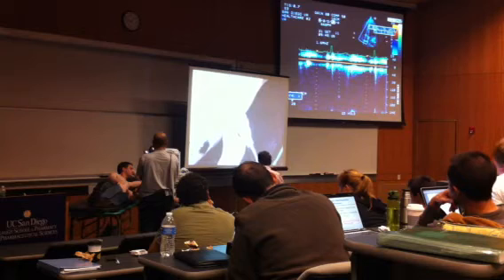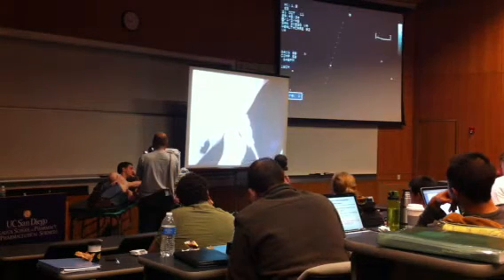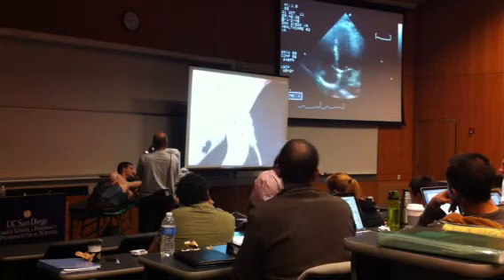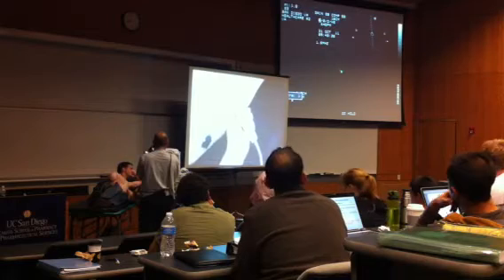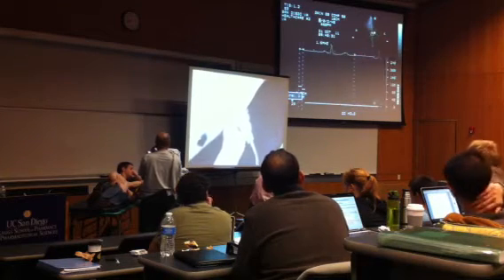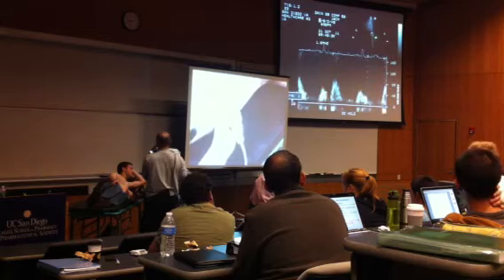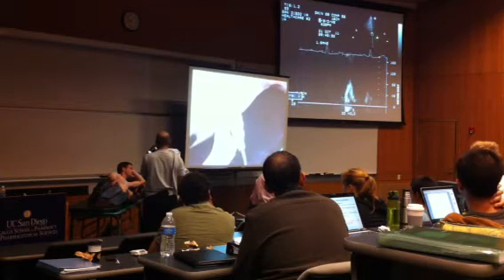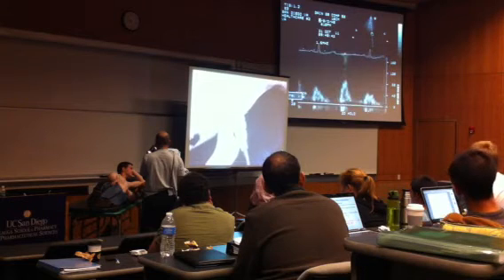Why don't we look at inflow? So let's look at mitral inflow. So we're positioning the Doppler cursor right below the mitral valve. Perfect. Okay, just freeze one when you get one back. Perfect. Freeze. Good.